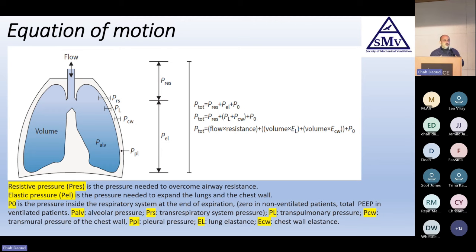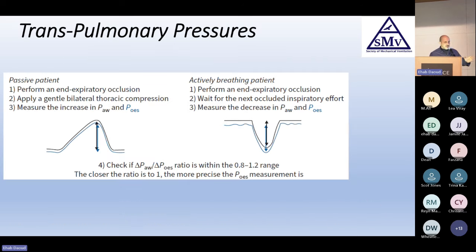All right, so how are we going to know that the esophageal balloon is in place? If we work together, you probably know that sometimes it becomes a struggle and it doesn't go into the esophagus. And after 15, 20 minutes, people start cursing, like, it's not going in, it's coming out of the mouth and whatever. So anyway, assume that it went smoothly. Usually you put it down to 50, 60 centimeters in the stomach, push, you make sure, then you start retracting.